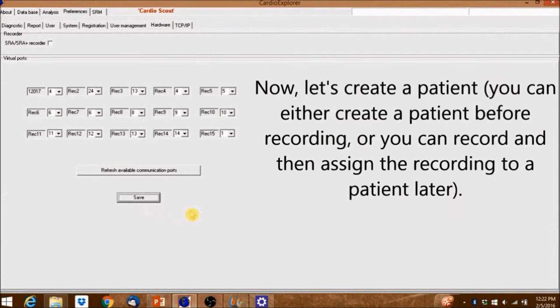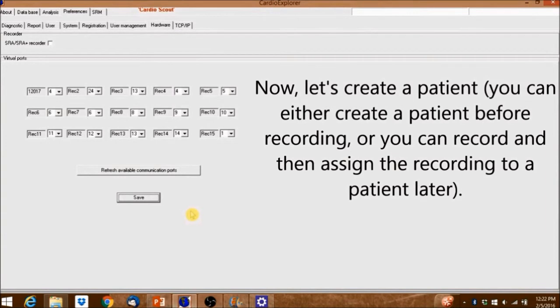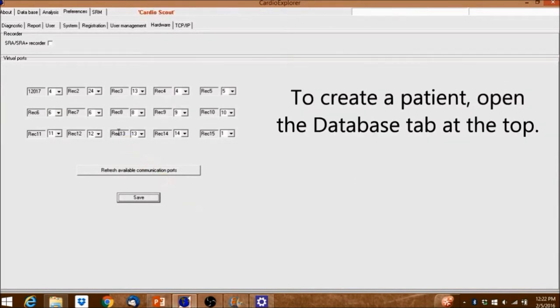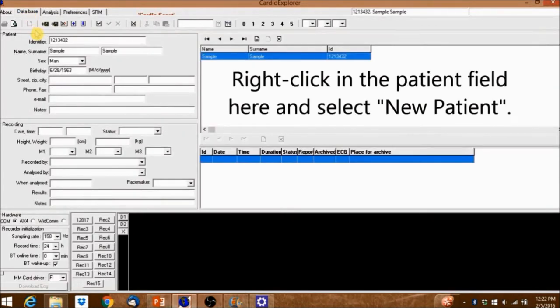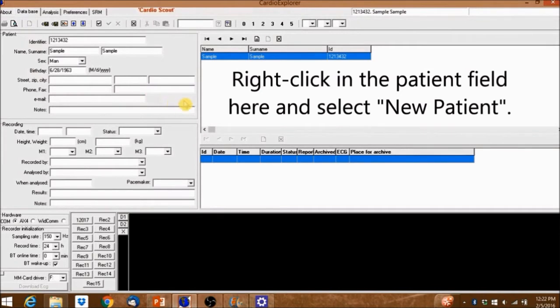Now let's create a patient. You can either create a patient before recording or you can record and then assign the recording to a patient later. To create a patient, open the Database tab at the top. Right-click in the Patient field here and select New Patient.